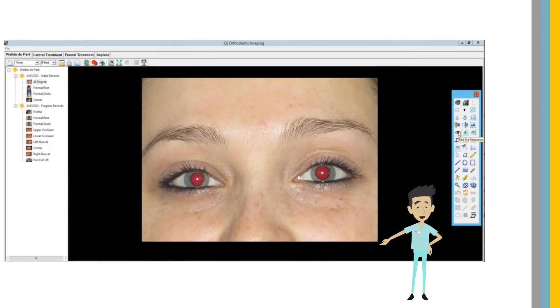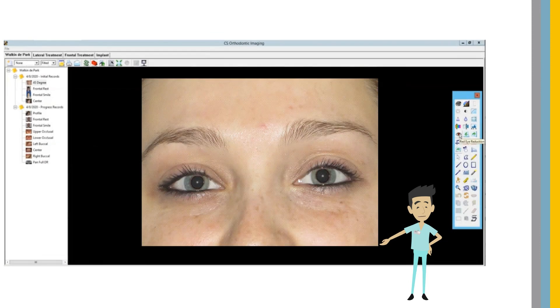The red eye removal tool has been updated. Now, pressing the red eye button automatically finds the patient's eyes and removes red eye.